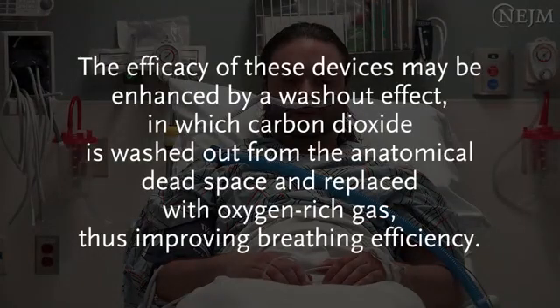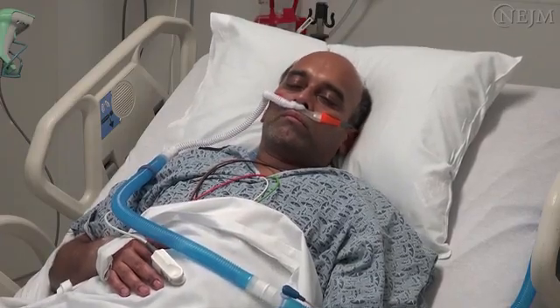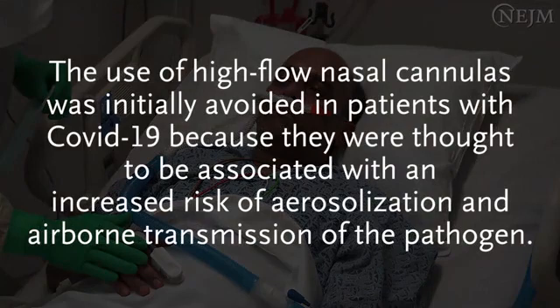The efficacy of these devices may be enhanced by a washout effect, in which carbon dioxide is washed out from the anatomical dead space and replaced with oxygen-rich gas, thus improving breathing efficiency. In addition, the administration of supplemental oxygen through a high-flow nasal cannula can reduce the need for endotracheal intubation and mechanical ventilation.